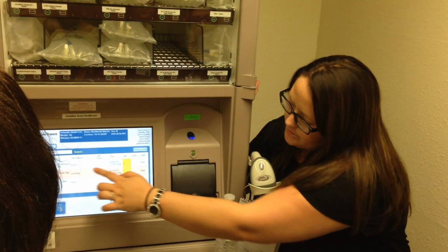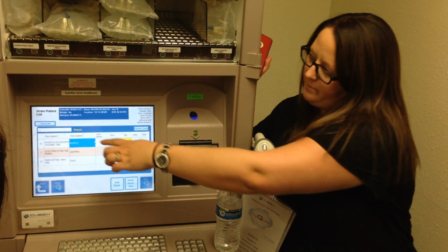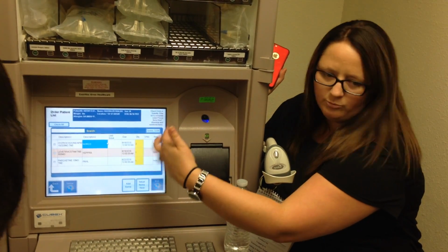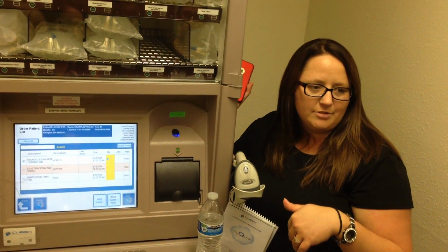If it says 0, so this is a Norco, yeah, this is a script for Norco. This patient takes 2 all the time. If for some reason it populates as a 0, it's a ranged PRN, 1 to 2. We have no idea how many you need.